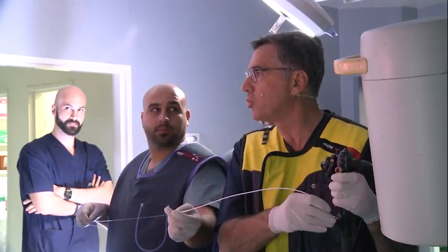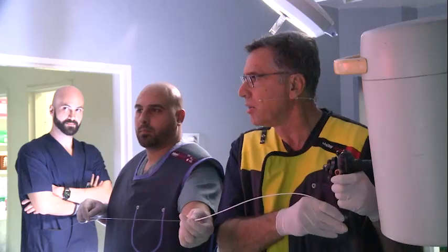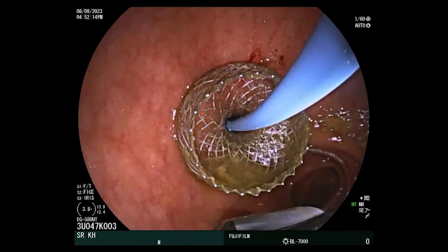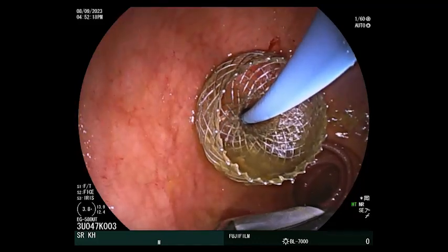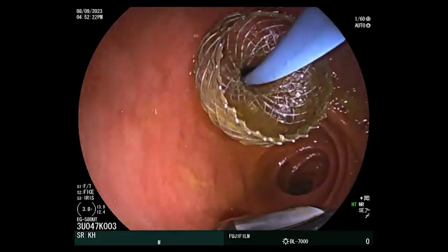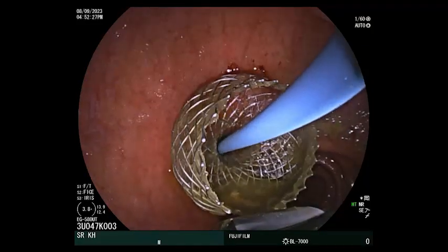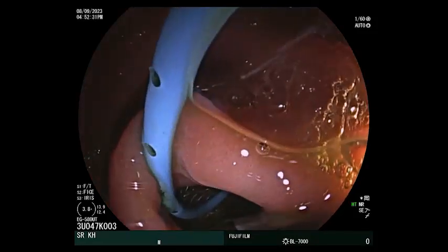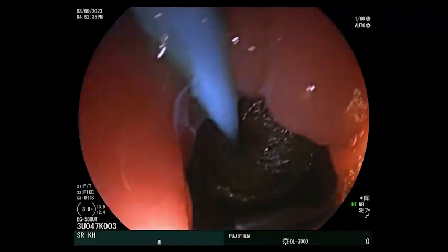Pull back a little bit the guide wire. More. Okay. Now I'm entering inside. You see, I just changed my position. Okay. So I think now you can release the guide wire. Okay. And I'll go back a little bit. Okay. This is done. This is finished, you see?